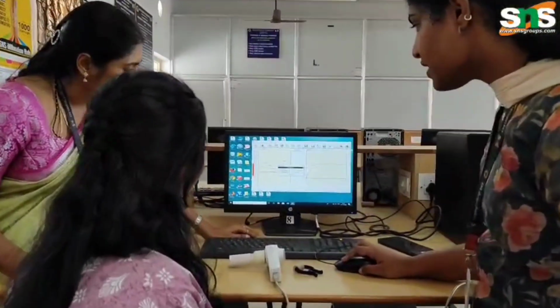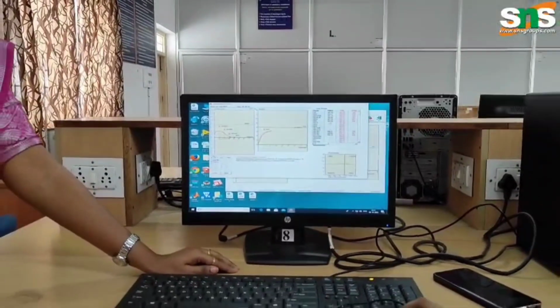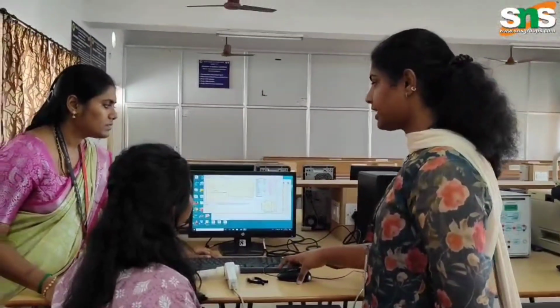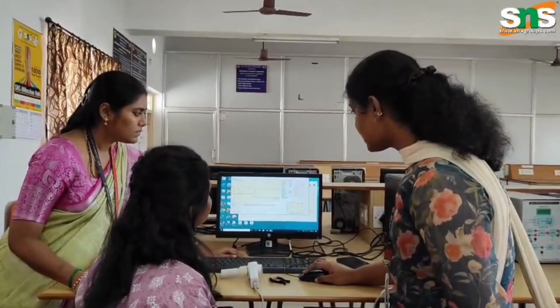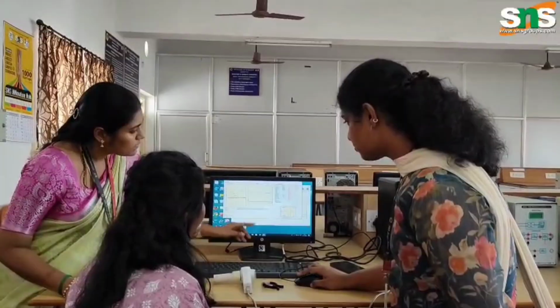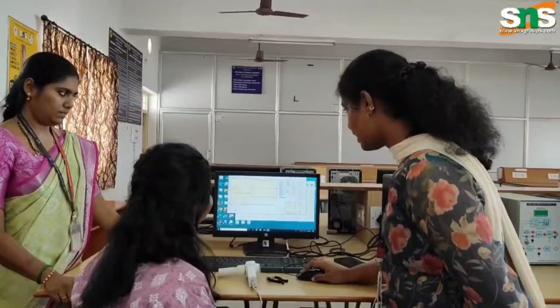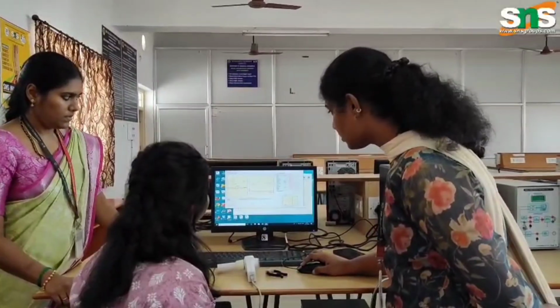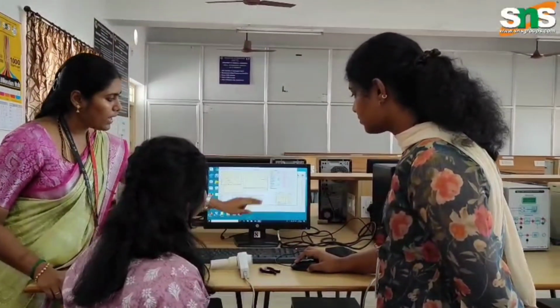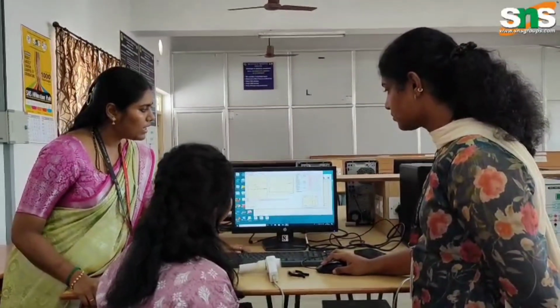In analysis we have another option called individual test. We can see the results for our individual test. We will take a set of tests, 2-3 times, to get accurate results. Now we have taken a single test, so we have only one test's values here. Parallelly you can see all the parameters and their numerical values. You can later check them for further calculation or other analysis.